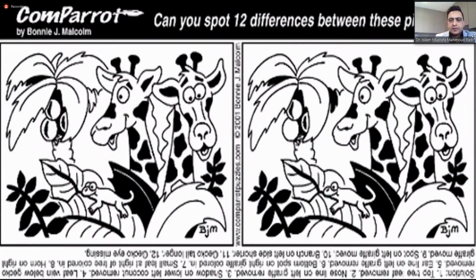For many years in my ultrasound teaching, I've been using this very simple method to simplify everything. You have two images, one image to the left and one image to the right. Imagine that the image to the left is a normal image, then the image to the right is the abnormal image. You have to get your eye used to this normal image so that when you see the right image, you start to understand that it's different from what you used to see. You will then have to describe why this image is different from the normal. And then when you can describe this, you can reach the diagnosis because you have already made the pattern recognition.